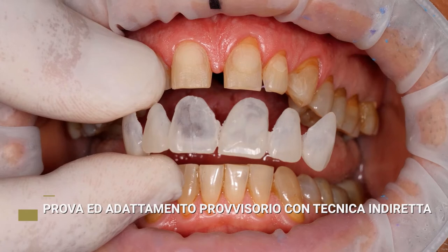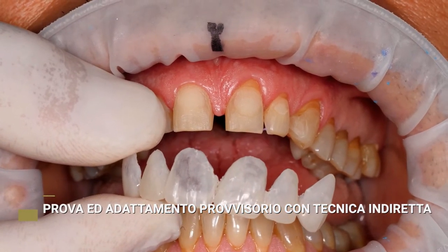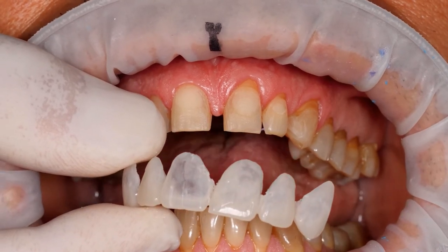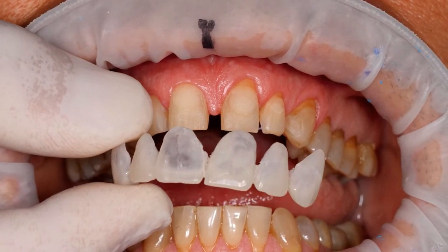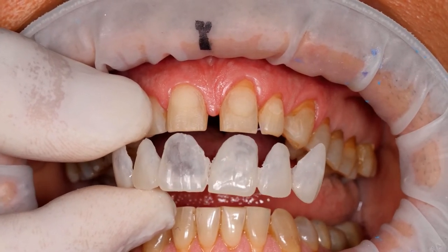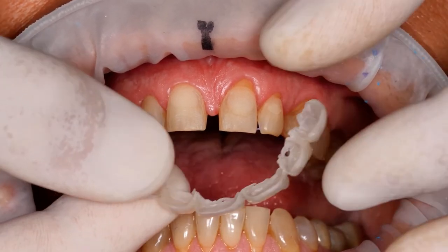Therefore, the wax-up really needs to be expanded a lot. And above all, as one of the trainees pointed out, the distal area of the cuspids always creates interferences. Therefore, the shell must be very thin.